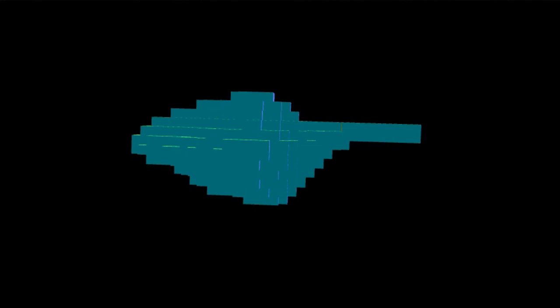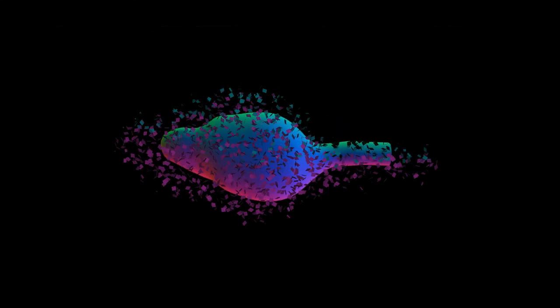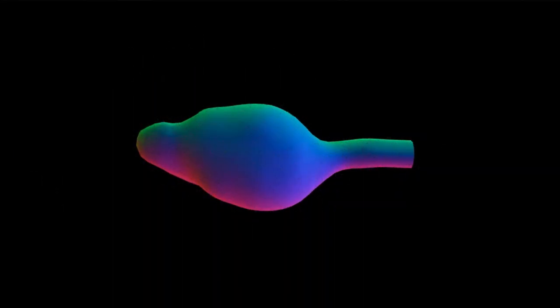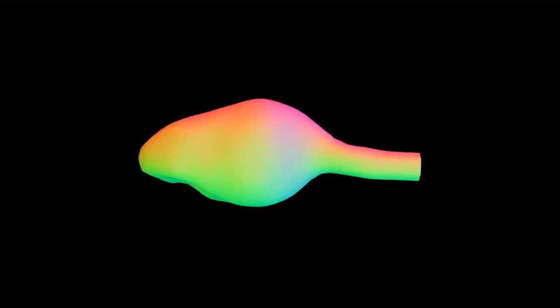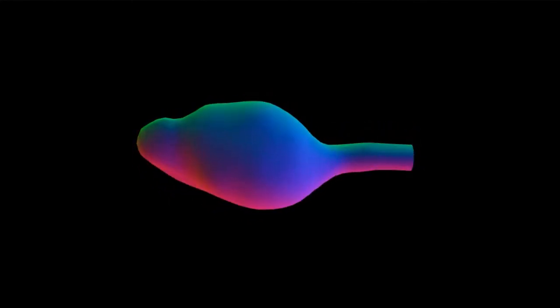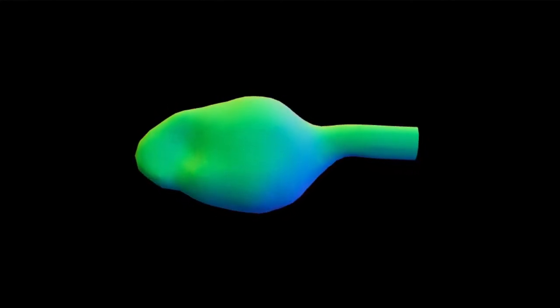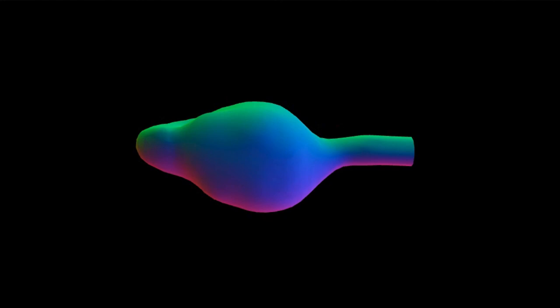By means of this space carving technique, we were able to build a 3D model of the sperm that can be rotated to permit viewing from any direction. While a lot of rough information can be inferred from this representation, the voxelized version of the spermatozoa does not offer significant surface detail. To address this issue, we employed the marching cubes algorithm to render the spermatozoan. In contrast to the raw voxel representation, the marching cubes algorithm is able to render smooth surfaces through interpolation. Here we can appreciate that the spermatozoan does in fact have unique features on each of its surfaces, and it is easy to appreciate how this information would be missed in the aforementioned bi-dimensional analyses.